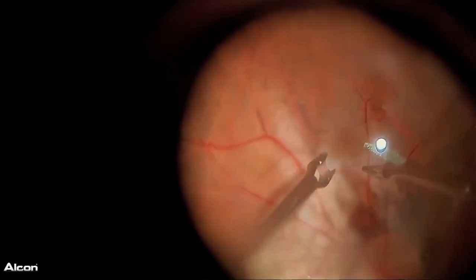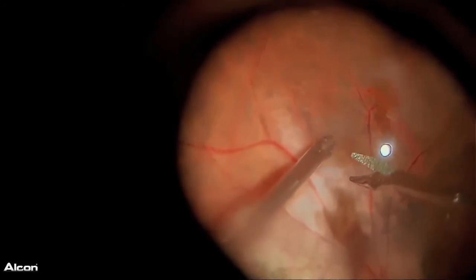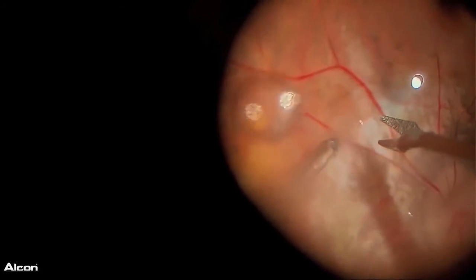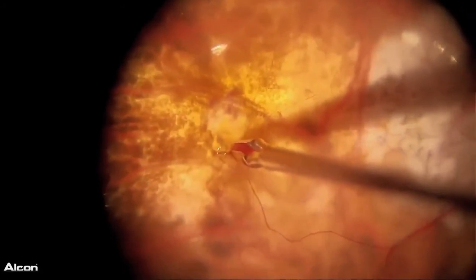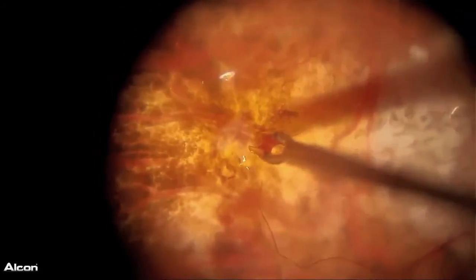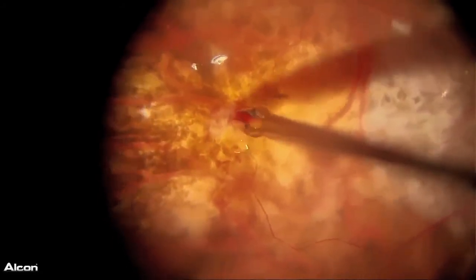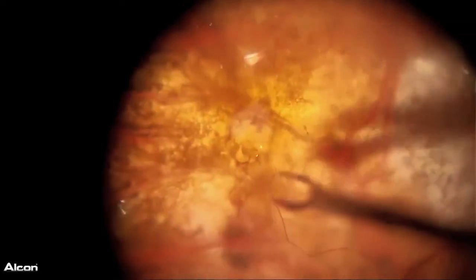But the Ingenuity system gives us better visualization and depth of field. And then the small piece of retina is placed over the large macular hole, and I make sure of good orientation of the harvested retina under perfluorocarbon liquid. And then I checked again the size of the harvested retina and its position, and it's in the right position covering the large macular hole.